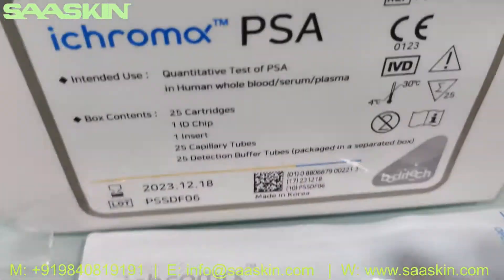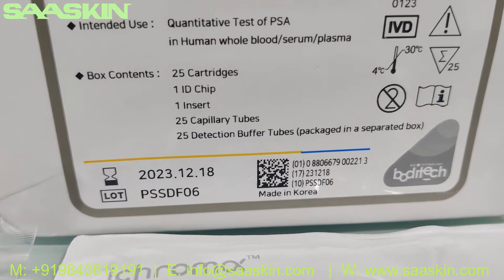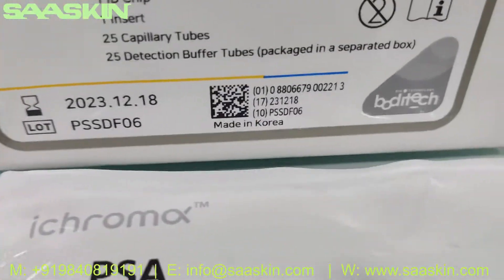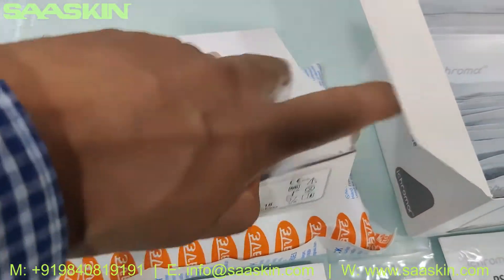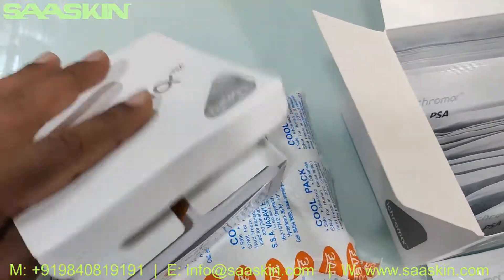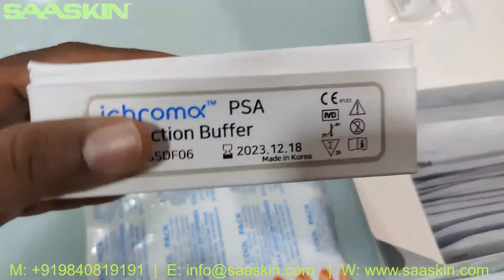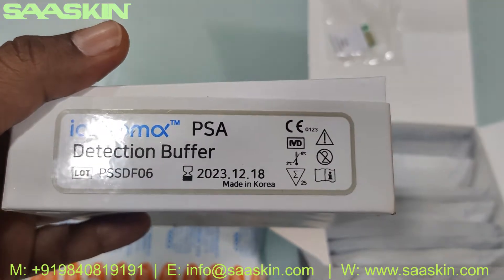As I said, this box contains 25 cartridges, one ID chip, one insert, 25 capillary tubes, and 25 detection buffer tubes. The buffer tubes must be maintained at two to eight degrees Celsius. I'll just open this — this is the buffer. Let me show you — ichroma PSA detection buffer, you can see it here.